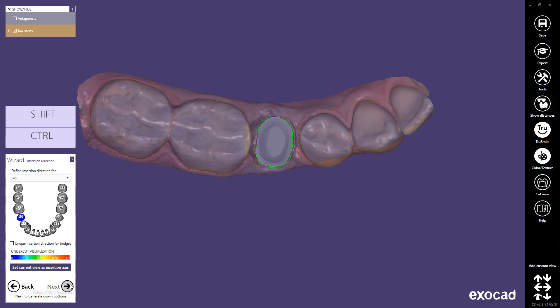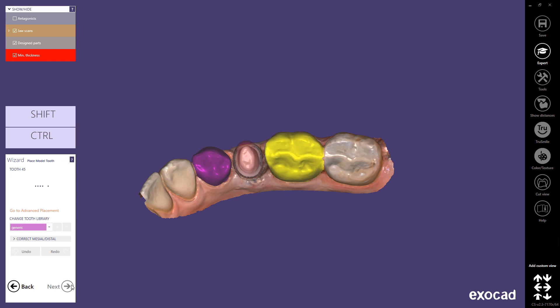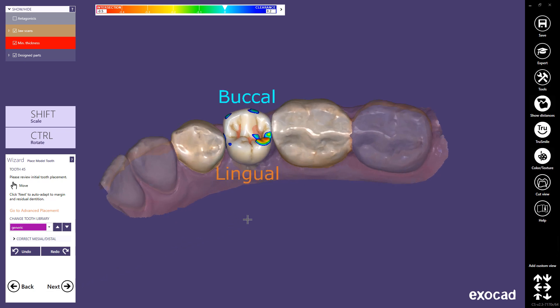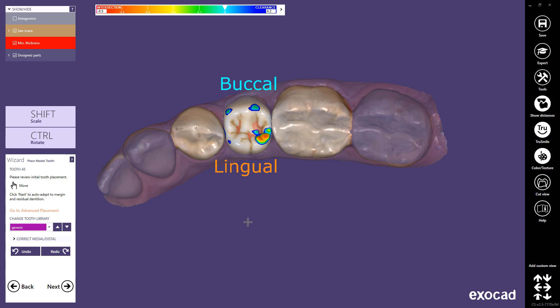To change the insertion axis, rotate the view so that you look onto the preparation in your desired insertion direction, then click Set current view as insertion axis. Click Next to proceed. Chairside CAD automatically calculates the cement gap of the crown bottom using the scan data geometry and the defined margin line. Material-specific parameters are considered in this calculation, so it's crucial to select the correct material and material configuration when setting up the job.